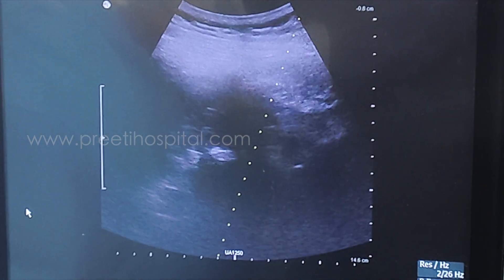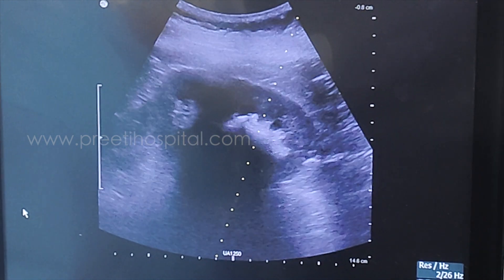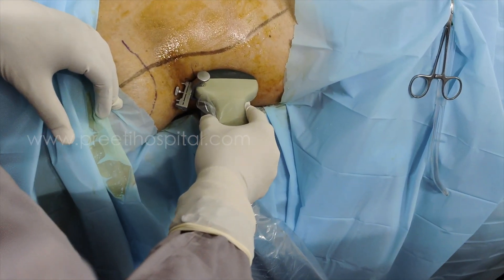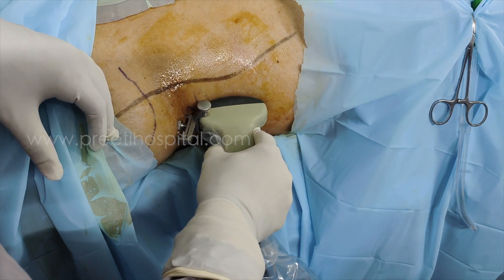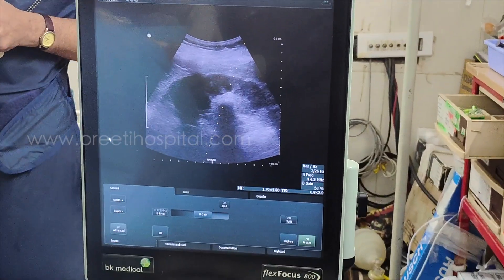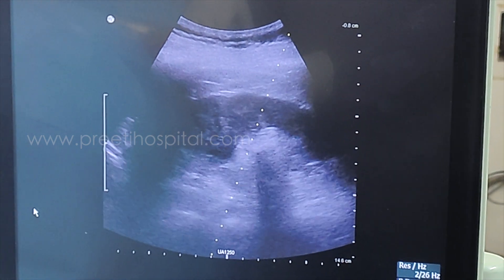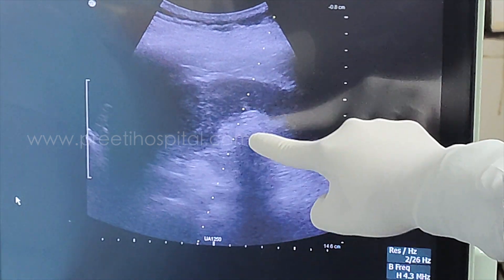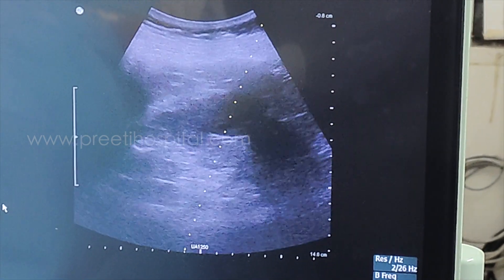Now, if you want to see the full kidney, you have to go back. The kidney is a retroperitoneal structure and with a little tilt — see, it was like this, kidney is not seen. When you tilt like this, the entire kidney length is seen. One most important thing is acoustic shadowing — the entire thing is acoustic shadowing. These things you should not miss.